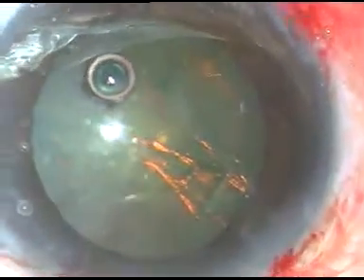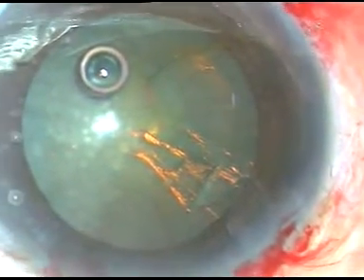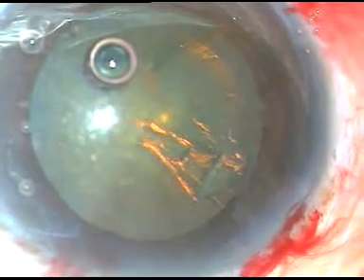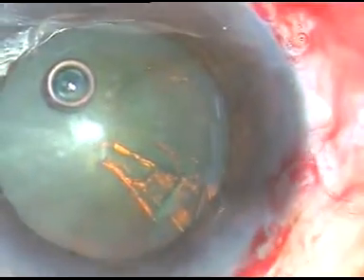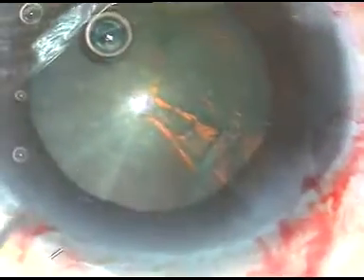Now hydro-dissection will not be done. The nucleus will not be rotated. I am just entering into the anterior chamber with the tip of the phaco handpiece at this stage. This is not my technique — this has been popularized by Dr. Narayan Bhardali at Jorhat, Assam.